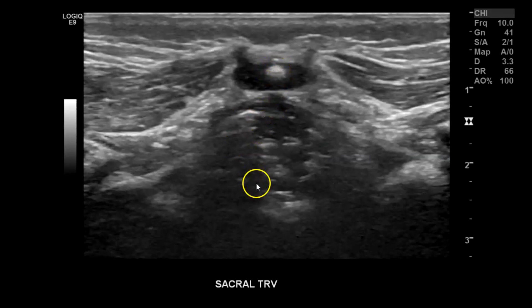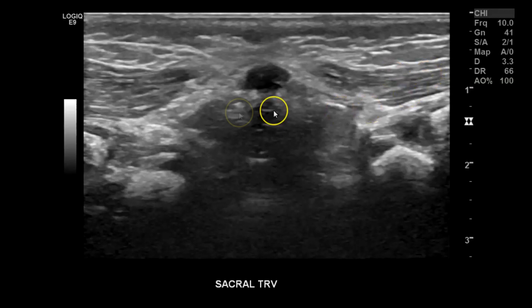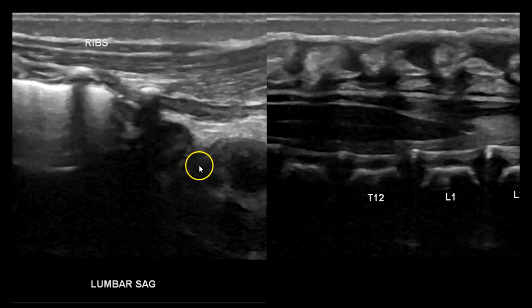Then I start going down to the sacrum. Here you can see the last sacral element, and you can confirm there are no dermal sinus tracts or defects within the skin. You can see the glute muscles right here. Then I take some more images of the conus medullaris and the cauda equina filum terminale region to make sure everything is in order. This little structure here might be a filar cyst, which we see quite often — it's usually not a big deal.